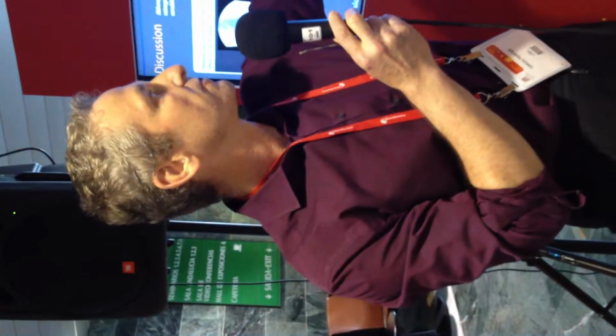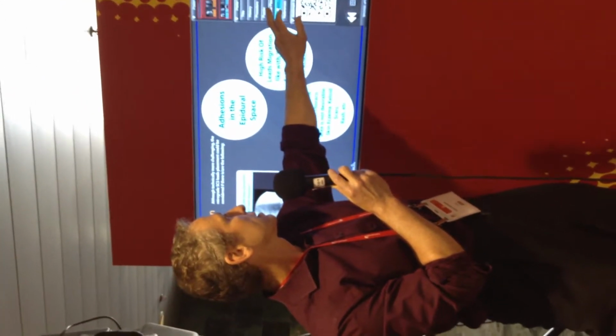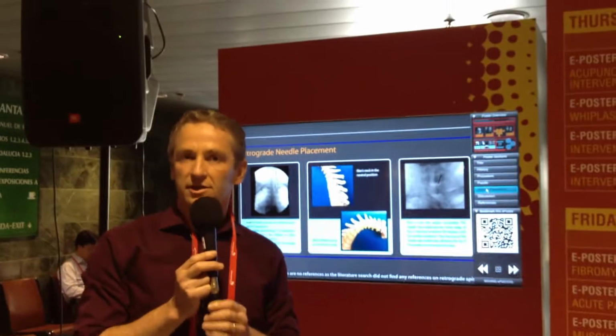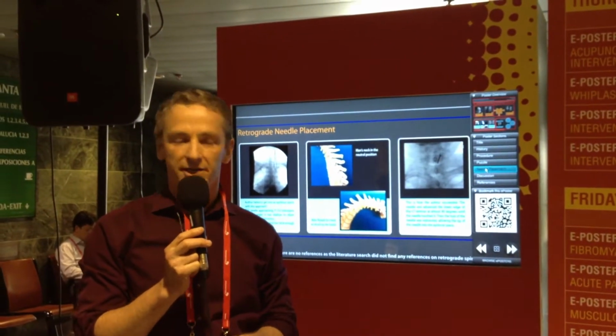Such a title? Yes, it's a retrograde spinal cord stimulator for radicular back pain. Do you like to solve puzzles? So do I. There are still two problems with spinal cord stimulator placement. One of them is lead migration.